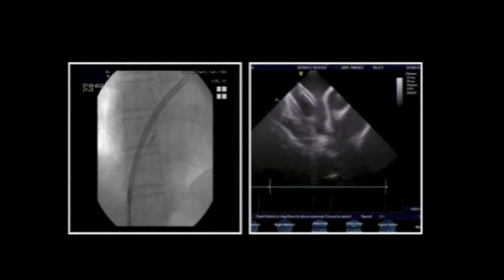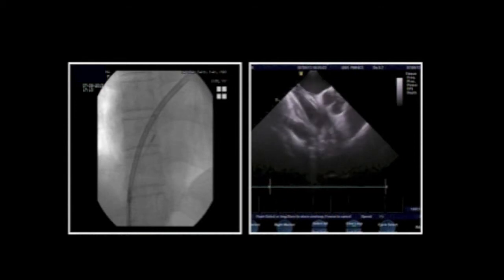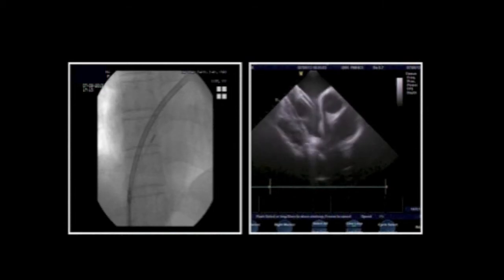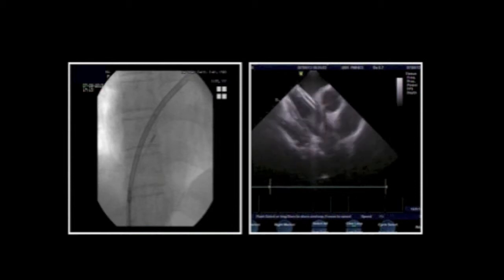I would advise you to do that because I was burnt with this before by cardioverting the patient after the device, and the device embolized. But then we need to call anesthesia down. I would do that for the patient before you deploy the device, because if she's in AFib, it's better to revert her to sinus, even if you have to put her under anesthesia, then you put your device safely.